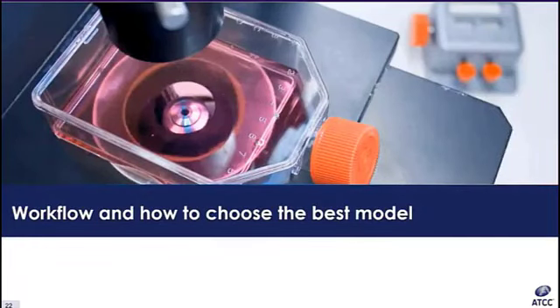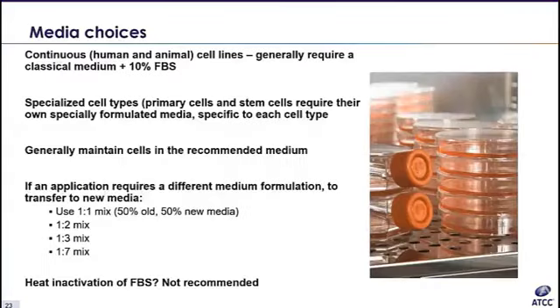So here I'm going to change focus and go into how you can choose the best model. When we're talking about which is the best cell model and why you would want to choose it, before you go into the models, I want to briefly discuss media.